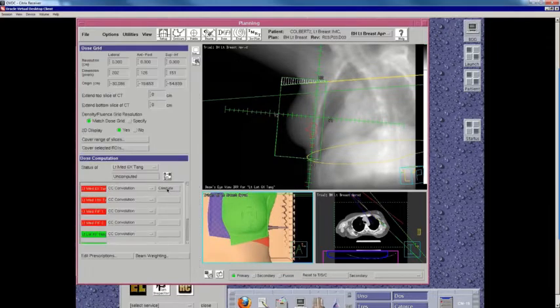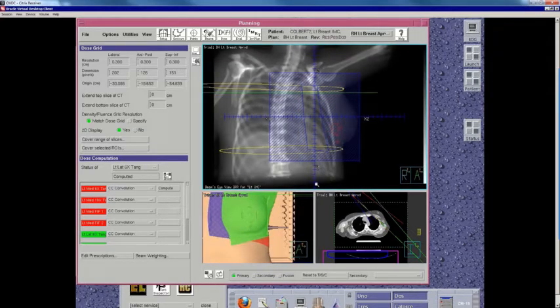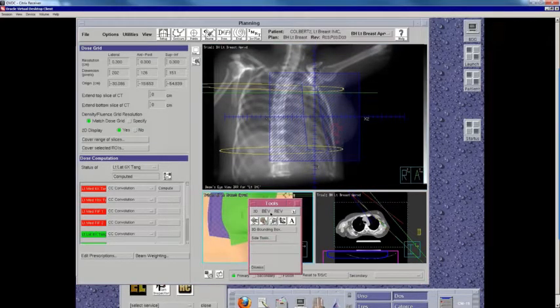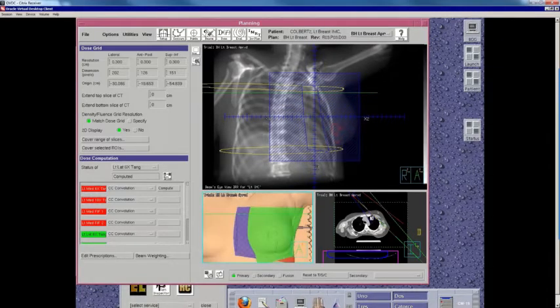So these are great tangent beams. Now we can talk about the medial breast beam that's called IMC here. So this is what this looks like. This is what this looks like on the skin rendering. And so when you're treating a breast and you're matching a medial electron beam to tangents, typically we like to use a hinge angle of about 10 degrees.